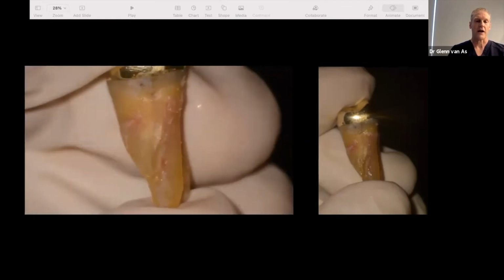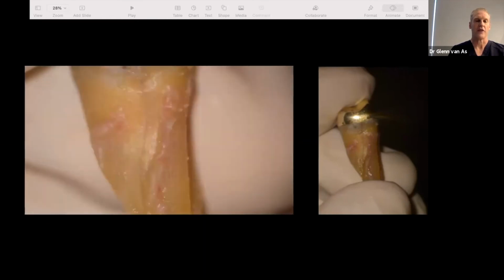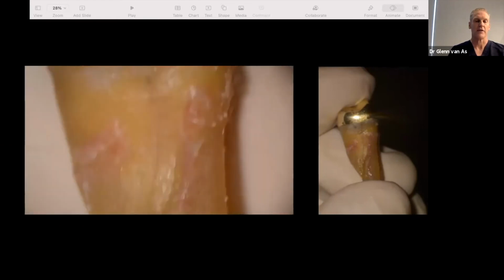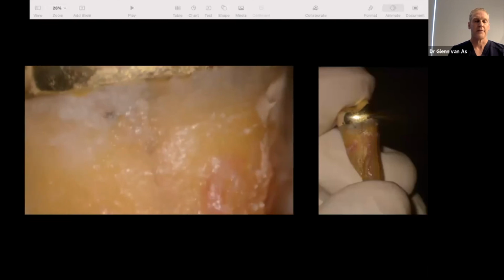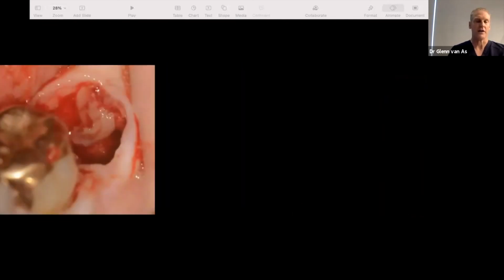Watch the crack progress all the way down from the distal margin, 8 power. Look at the crack there, all the way down, right to near the apex, and you can see these cracks. You can see them with methylene blue, but that tooth is toast, and that's why the bone loss was there. And so you've got that socket that you saw, and now you want to remove the granulation tissue and disinfect.